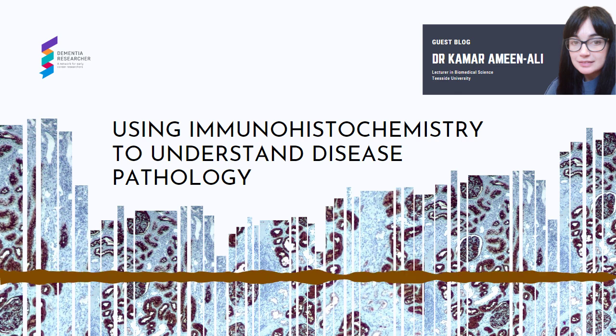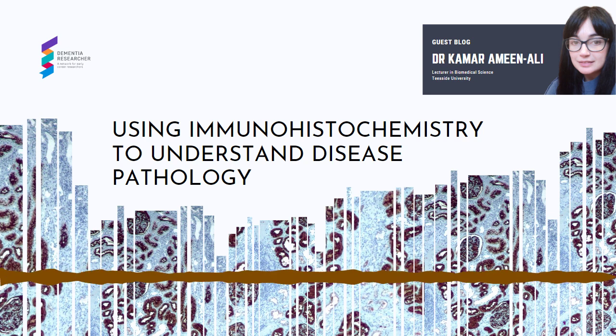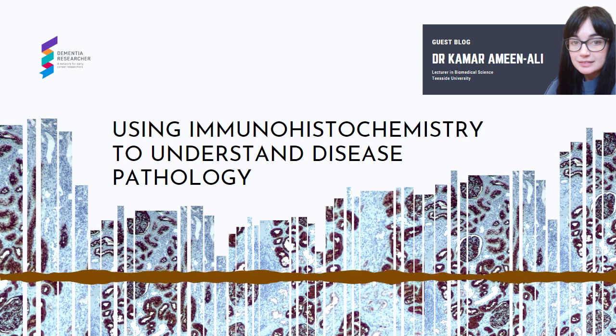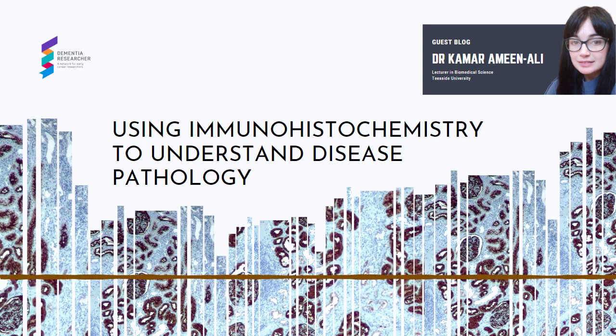These staining methods are typically done on thin tissue sections, which are embedded in paraffin wax, which is removed prior to the staining. When the staining protocol is completed, a cover slip is placed on the slide and it can then be viewed under a microscope. There are many more steps involved in this process, but hopefully this gives a basic understanding of the theory underlying this technique. Having a good working knowledge of immunohistochemical theory is essential for any scientist working in pathology, and I've learnt that this can lead to various superstitions.